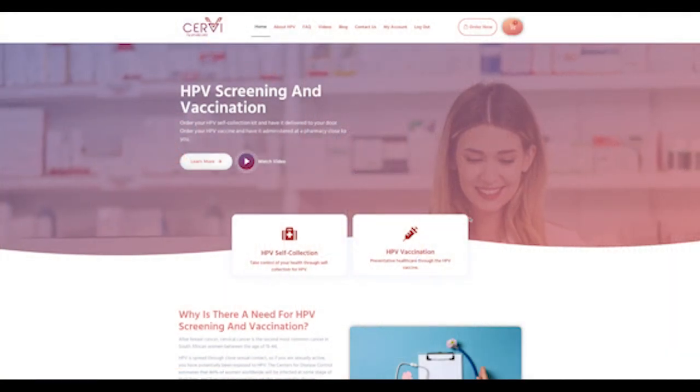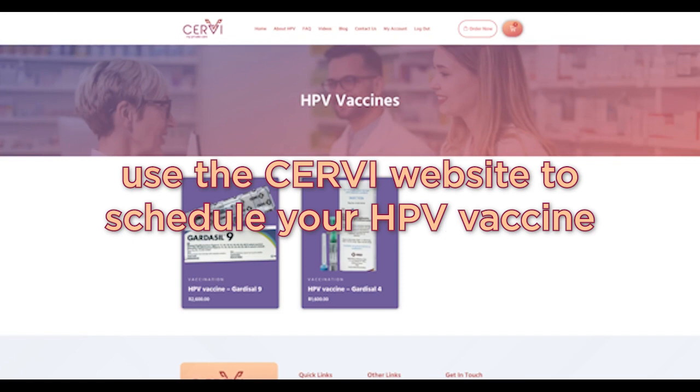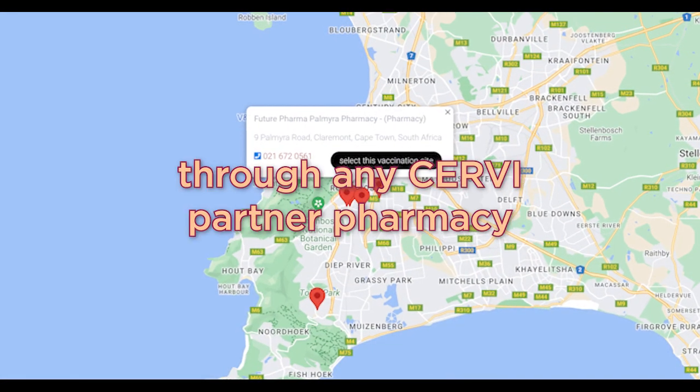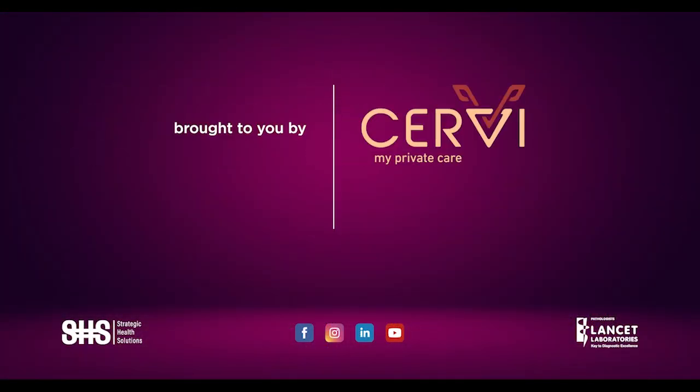Remember that you can use the Cervi website to schedule your HPV vaccine administration at any of our partner pharmacies. Congratulations on successfully completing the Evalyn HPV self-swab test with Cervi.